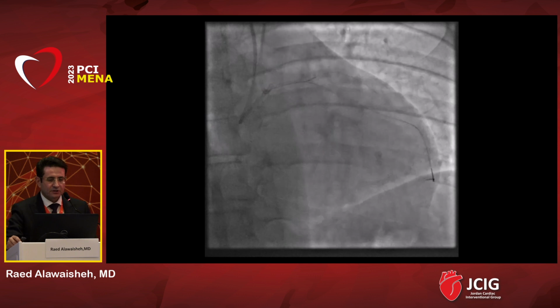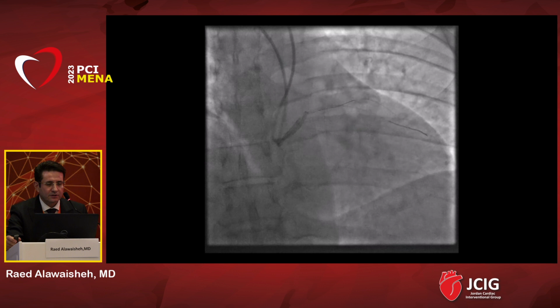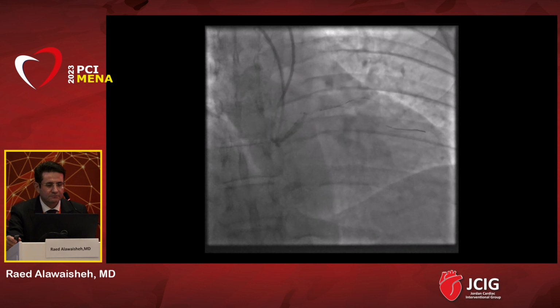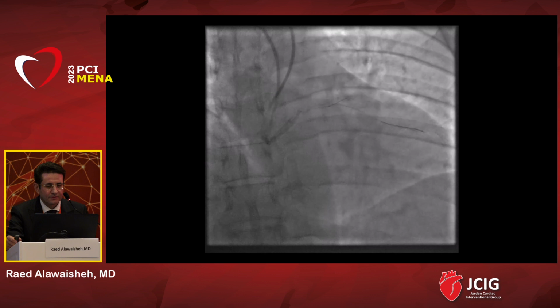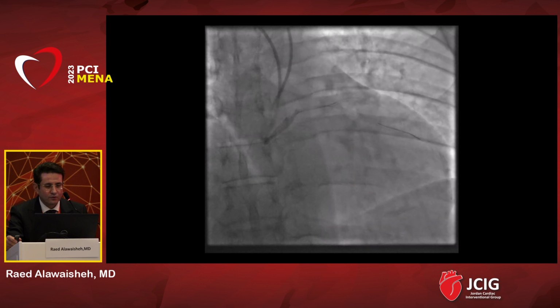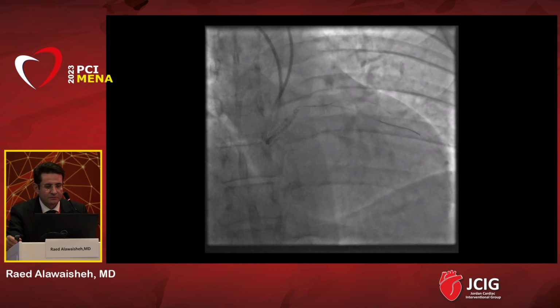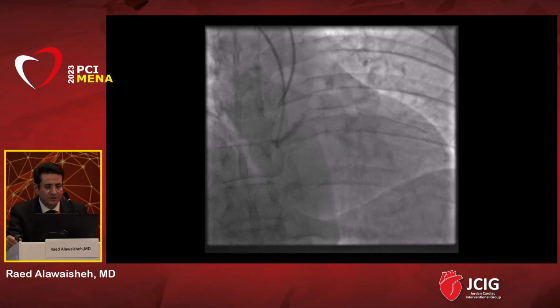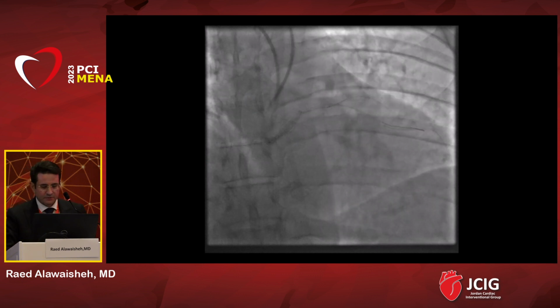And here, getting the wire inside the other catheter, and then you do the externalization. It's a long one, but at the end of the day, the wire went in. You need some trials. I think now we are in. As you can see here now, the wire is in.